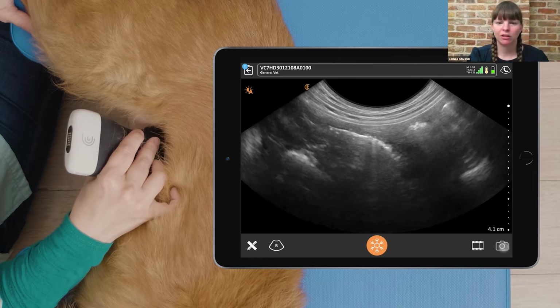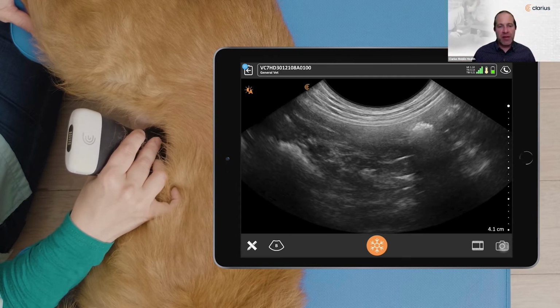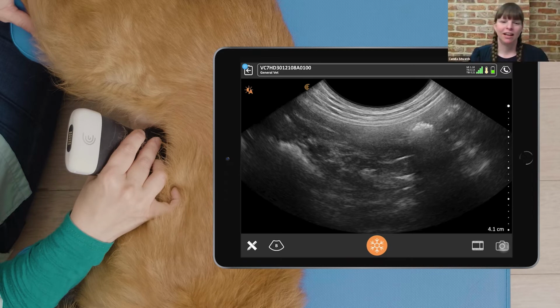The good news is that pathology is more notable. If there are abnormal lymph nodes, they will pop up much more readily, but that shouldn't discourage people from scanning to get to know what they should expect and then be surprised by the pathology. Exactly, so we love practicing. Practicing is really useful and gets us used to what normal is, but don't be disheartened if you don't find these lymph nodes in every patient. If you're looking in the right areas, you'll see them when it's important.